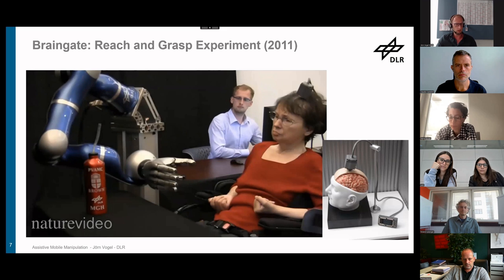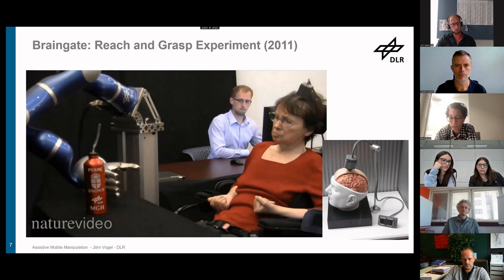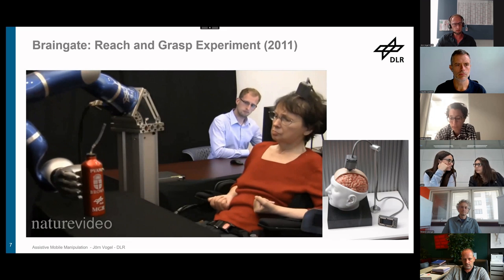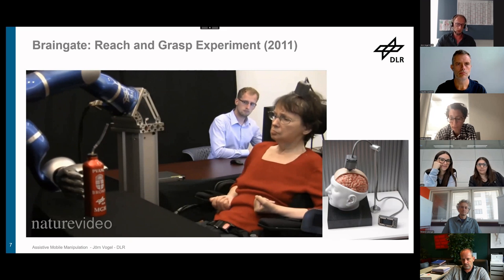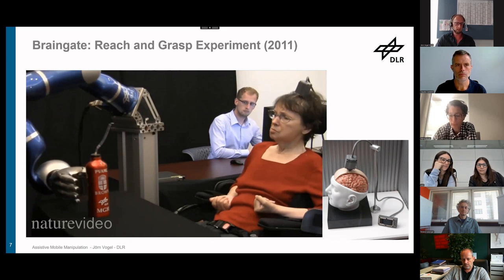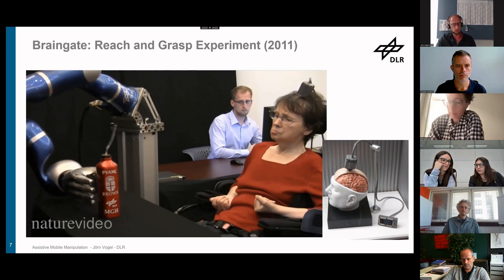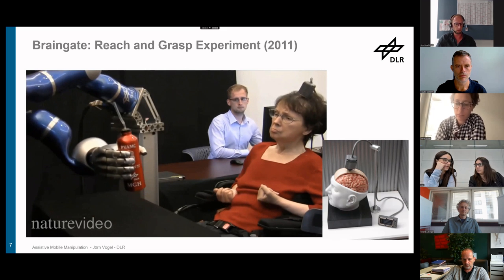basically I worked on, early on, a set of alternative interfaces to a joystick, but with 3D control. As you can see here in the BrainGate experiment that I worked on in the early days in DLR. So this is a video from 2011. It's quite a time ago, but the topic of invasive brain interfaces is very much up to date, given all the work that's going on there with Neuralink and other companies trying to commercialize those ideas now.